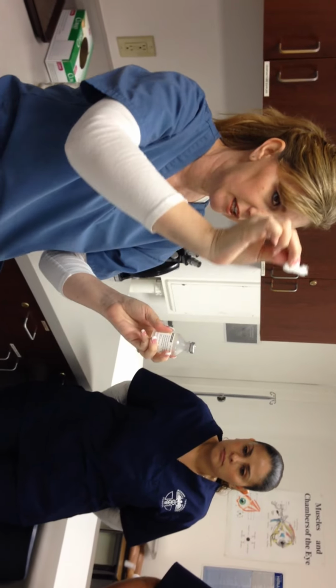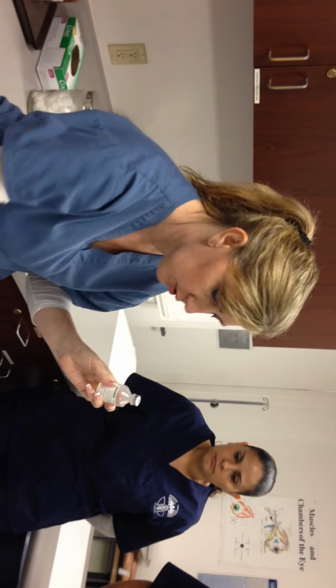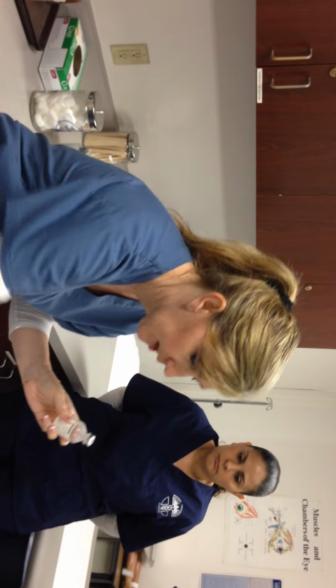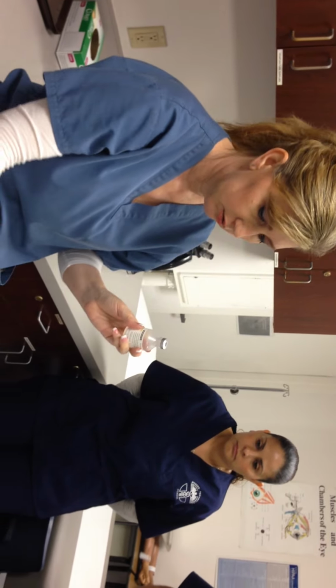Where does this go? Am I clean or dirty? Dirty area. Dirty, right? See, that way, if I just throw it over here, wherever, whatever, and then I use this for my patient, do you see that? No, put it over here, okay?